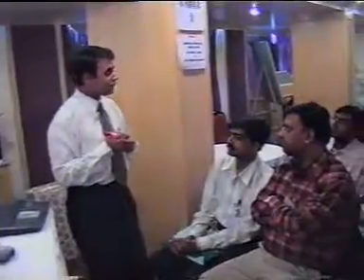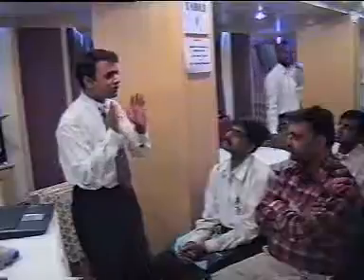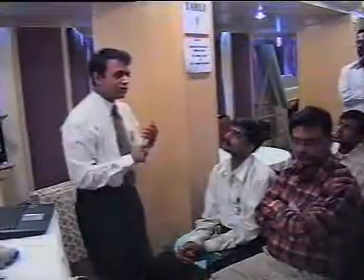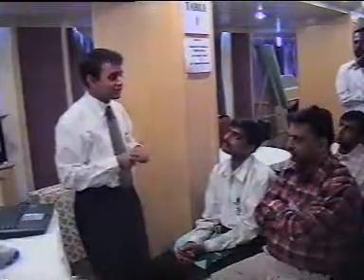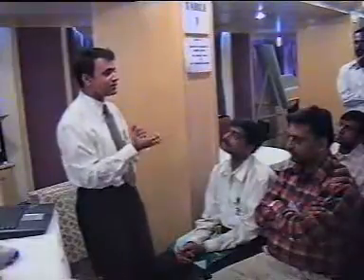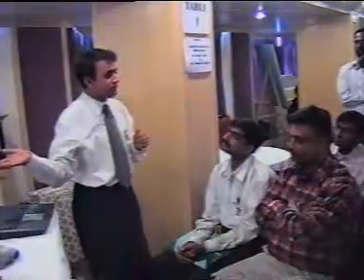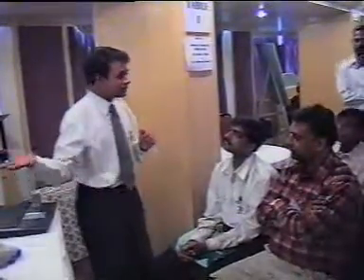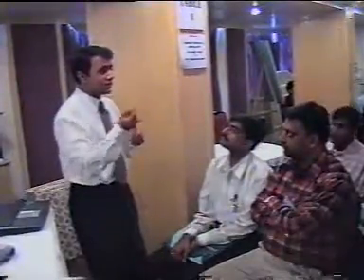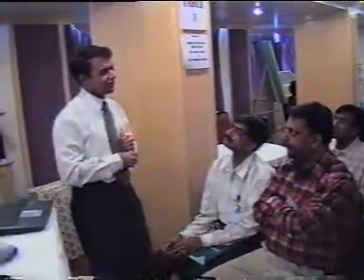You look at the baby's activity, you look at what concentration of oxygen the baby is receiving. Whenever you are giving therapy, this will be repeated very often. You look at what therapy you are giving. You monitor the therapy and you monitor the effect of therapy. So if you are giving oxygen, you are supposed to monitor oxygen, and next you are supposed to monitor the effect of oxygen. The effect of oxygen is monitored with, as I said, color, that is clinical evidence. Second, you go to a non-invasive method, that is pulse oximetry, the giant of today. And second thing is now there are transcutaneous monitors also available. And third thing is ABG, which Dr. Devpachar is going to take for you. Fine?